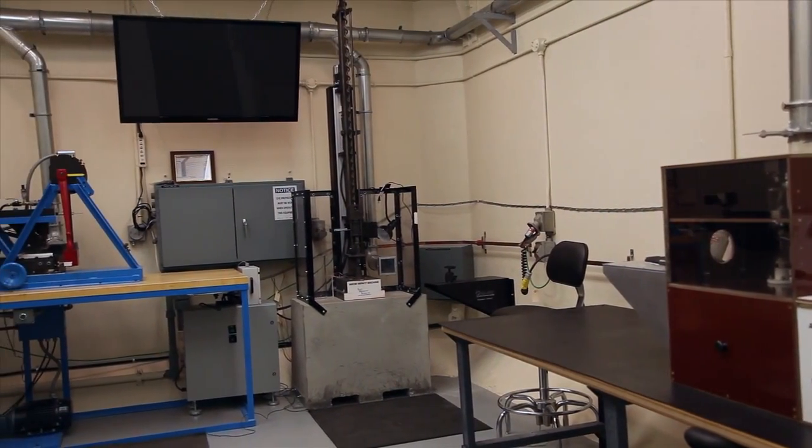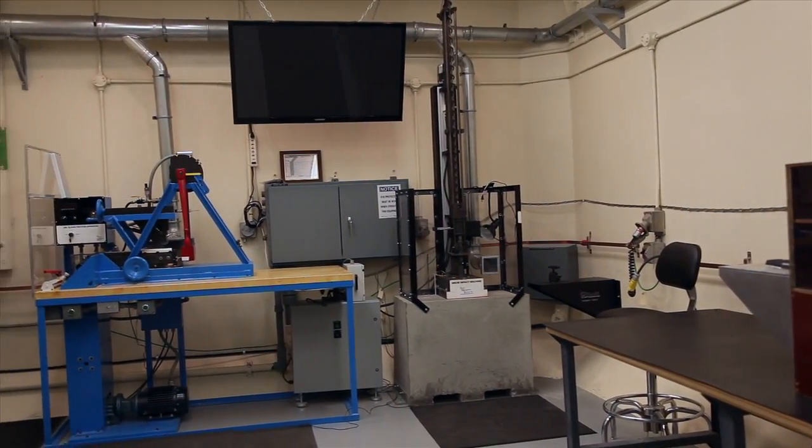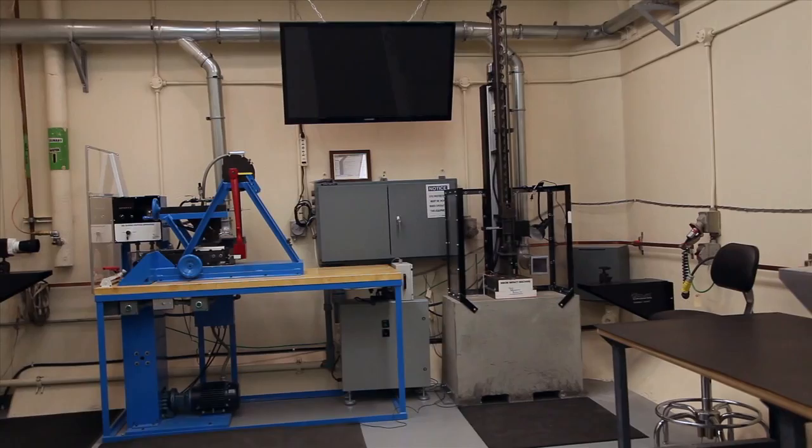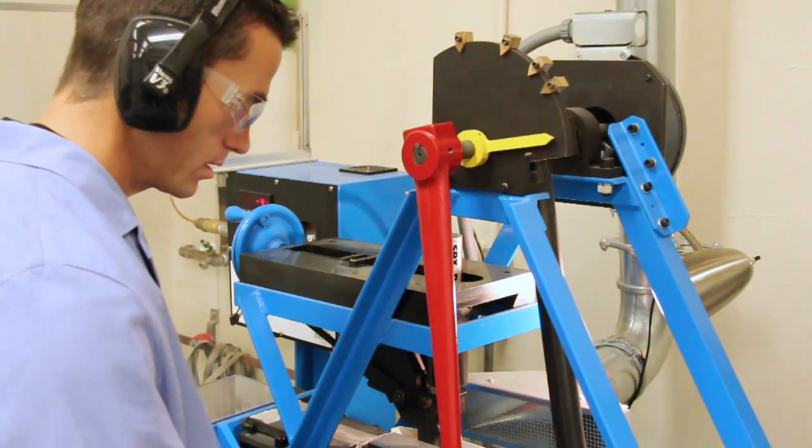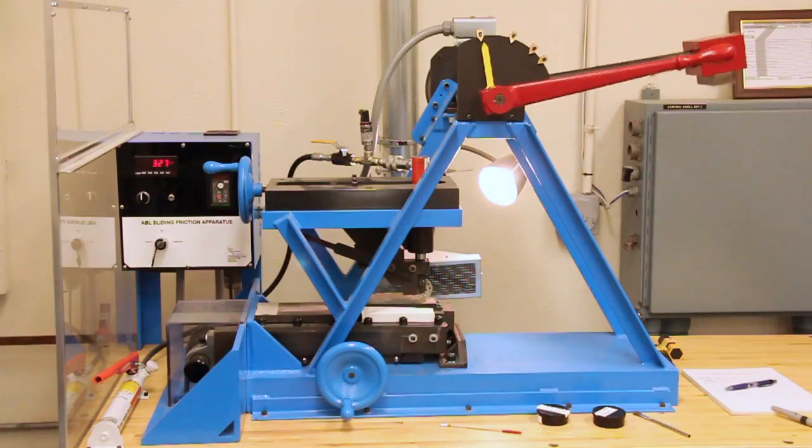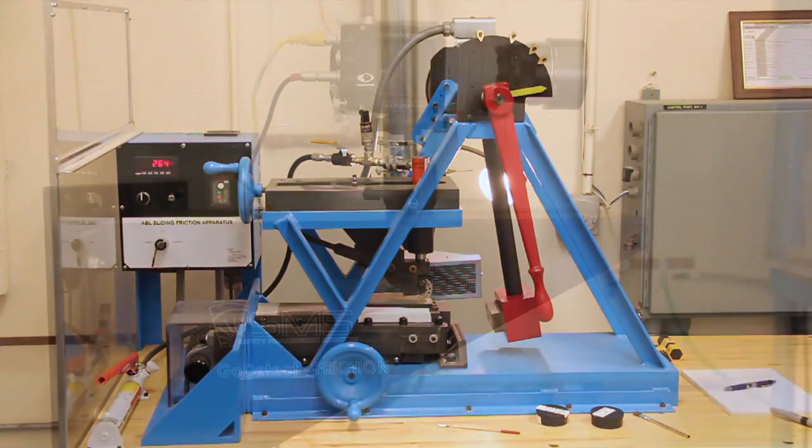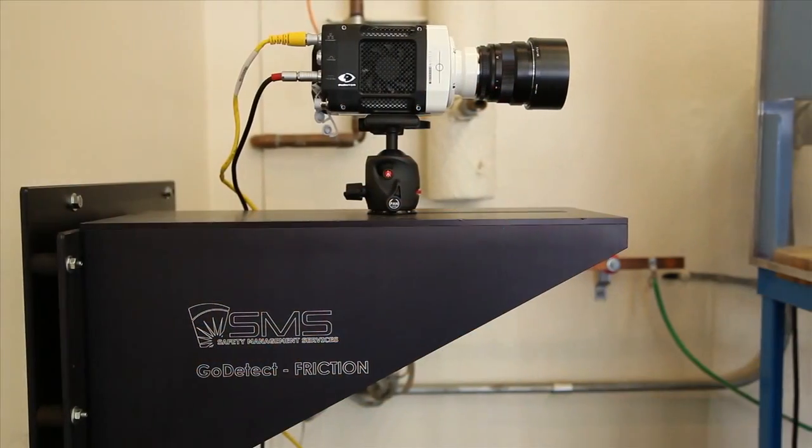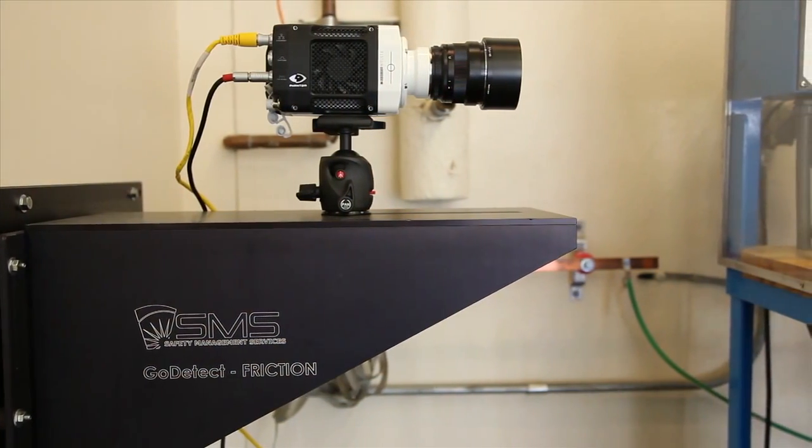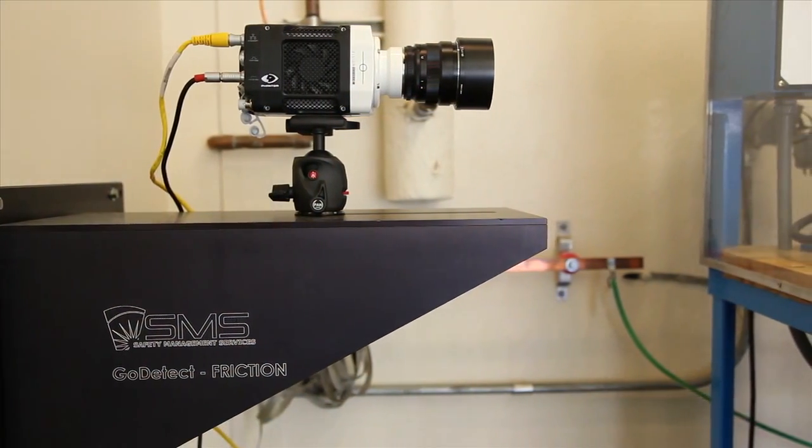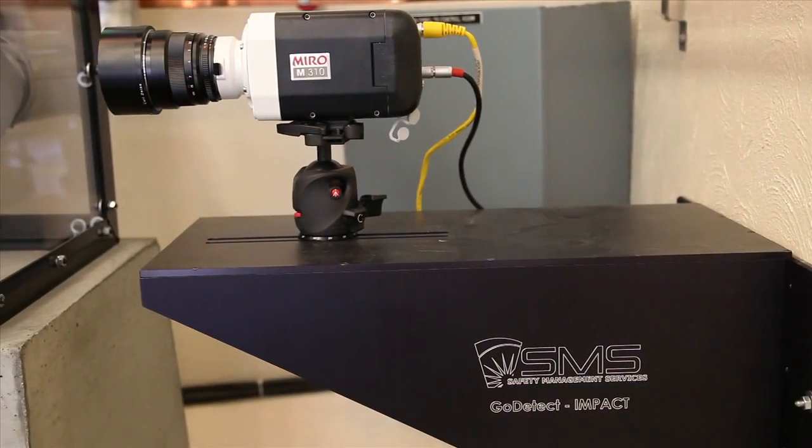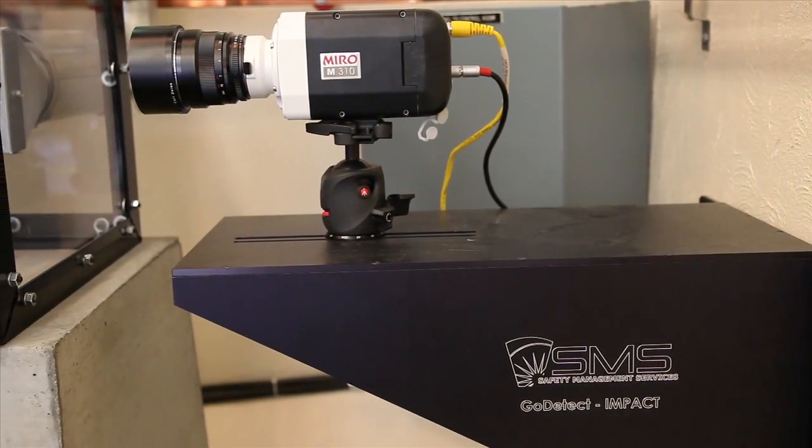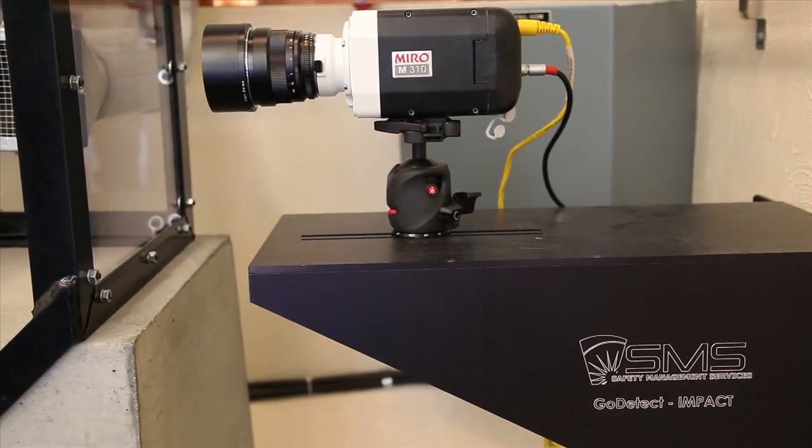In the past, test data acquired from sensitivity testing has been reliant upon the test operator's ability to differentiate a go versus a no-go reaction. This potential source of error has been eliminated by SMS with the development of the high-speed video reaction detection method known as GoDetectView.